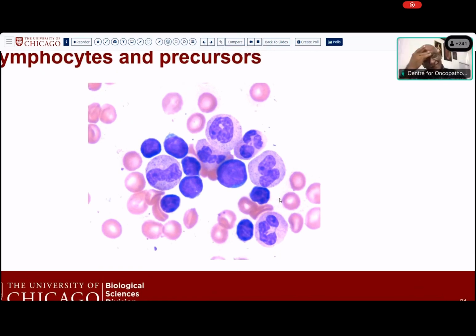So, Kriti, you want to try? Anyone who has not spoken or who does not have much experience, because I think this is a particularly good field for showing what hematogones can be, and how not to confuse them with blasts. This field, this slide especially. Anyone? Sir, I'm Kriti, sir.